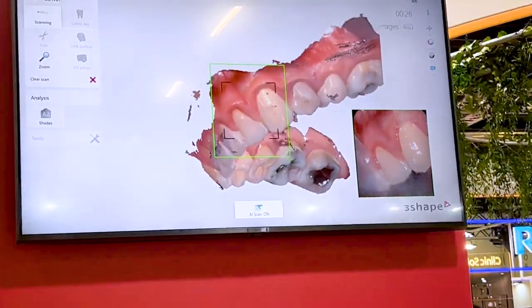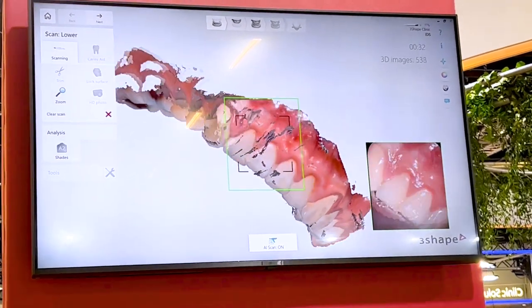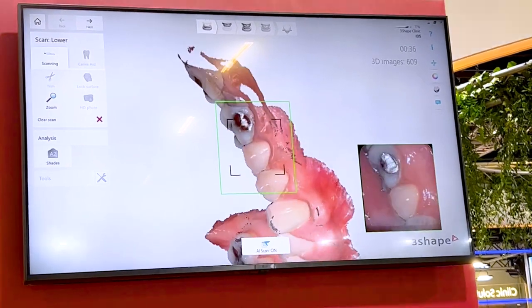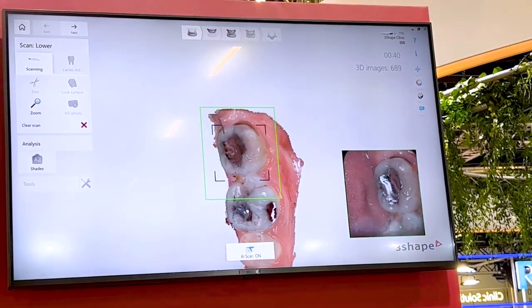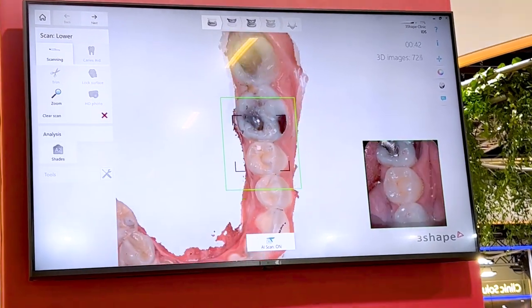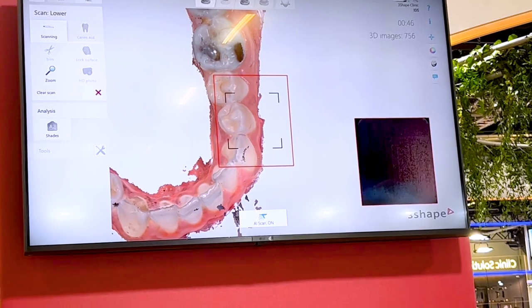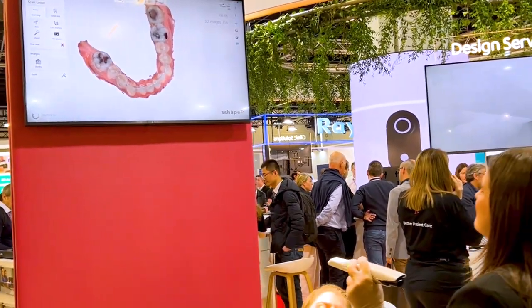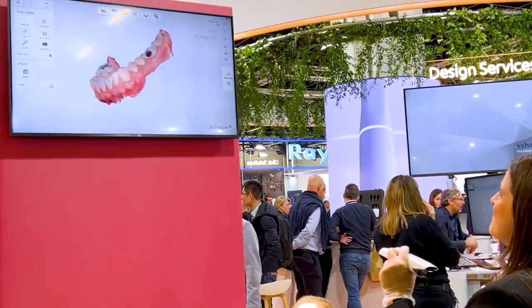You can see how the stitching works smoothly. We are now scanning the lower mouth, which is the hardest compared to the upper mouth because you have the tongue and the cheek. You can see the AI removing soft tissue and doing a nice clean scan. In less than a minute you can do a complete scan, and you can move it around to check for good coverage.